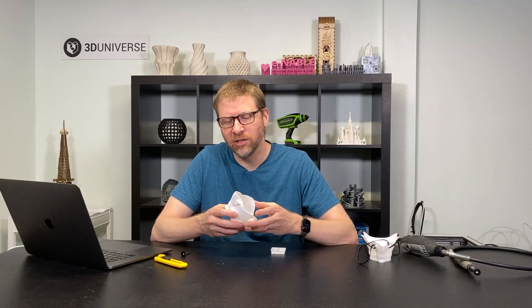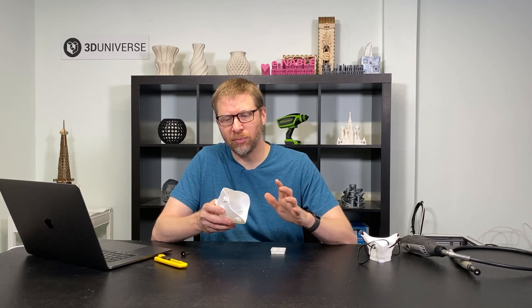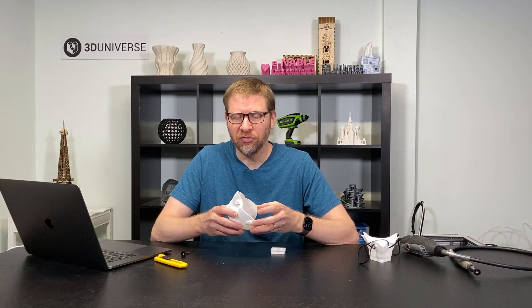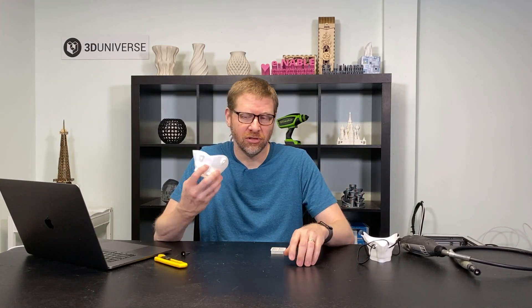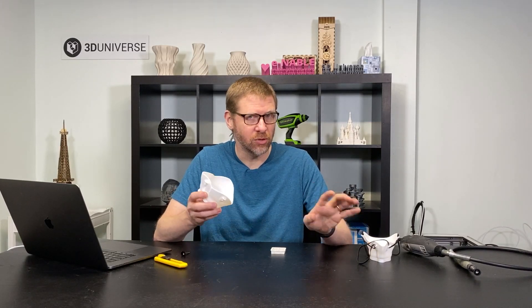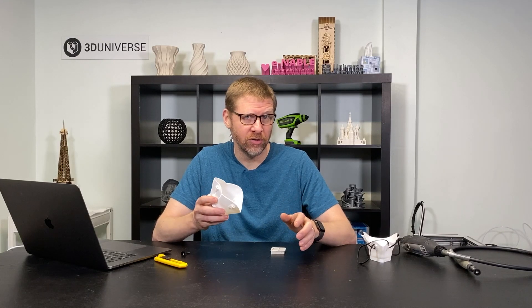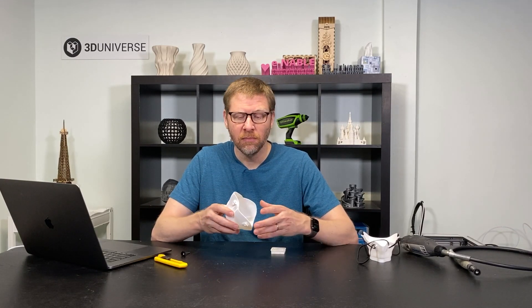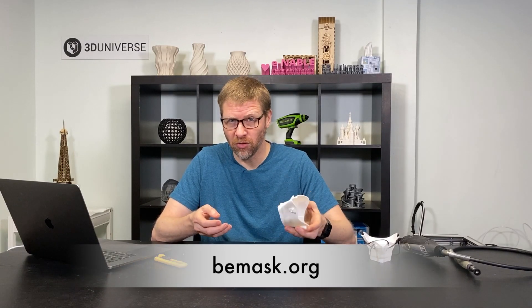The most important thing when printing TPU in most cases is keeping the speed slow. You're going to want to print this material much more slowly than something like PLA. If you're used to printing at 70 or 80 millimeters per second, for TPU you're going to want to go more towards 25 or 30 millimeters per second in most cases. The specifics will vary based on your specific printer and the brand of TPU, but we have some recommended settings at bemask.org.